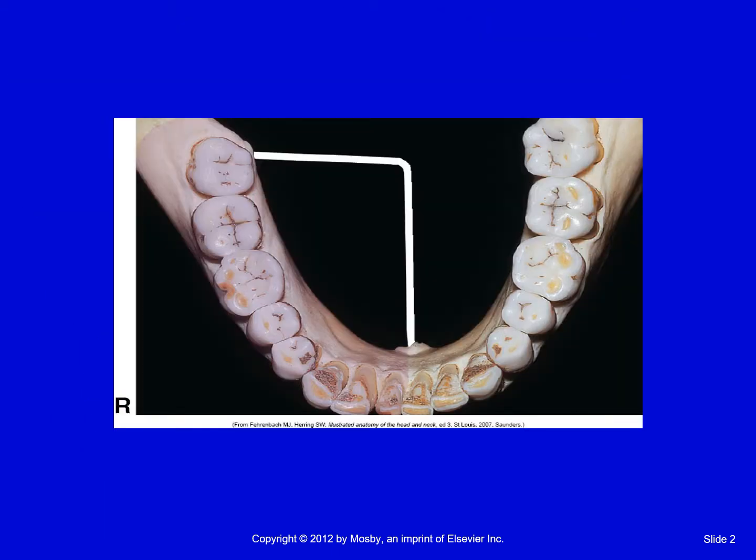And this is showing, you can barely see the pink around there, but it definitely gets, you know, from here, it gets all that soft tissue. It gets around the distal. It gets around the buccal. It gets the soft tissue and everything of this whole entire arch.